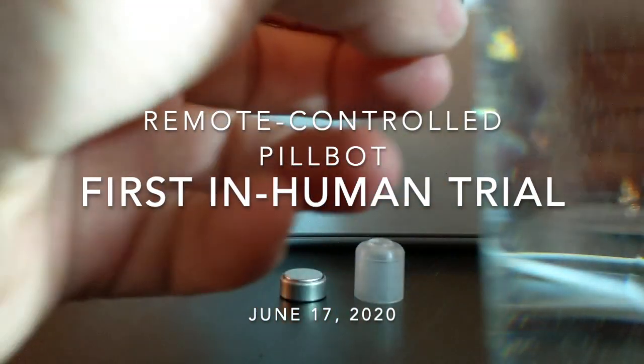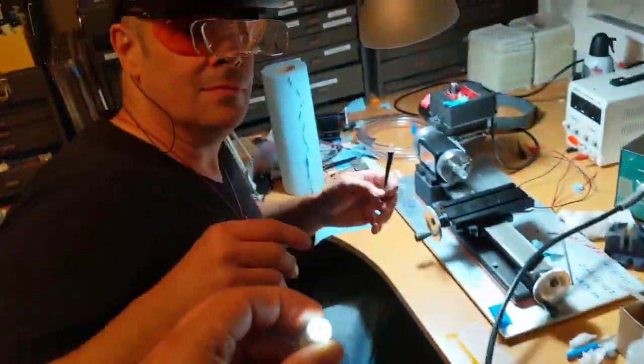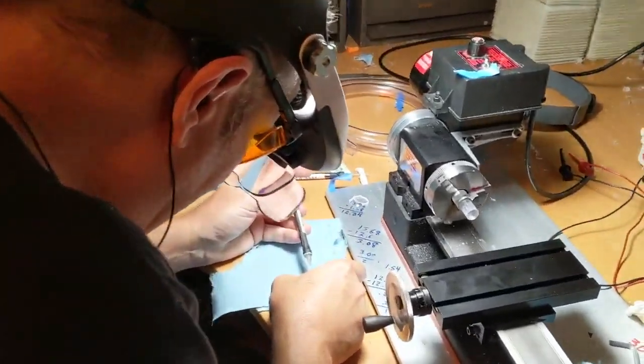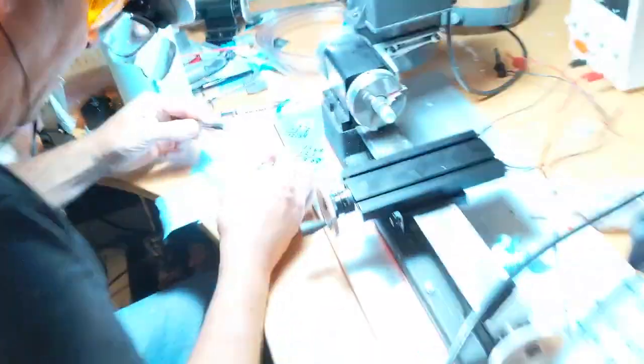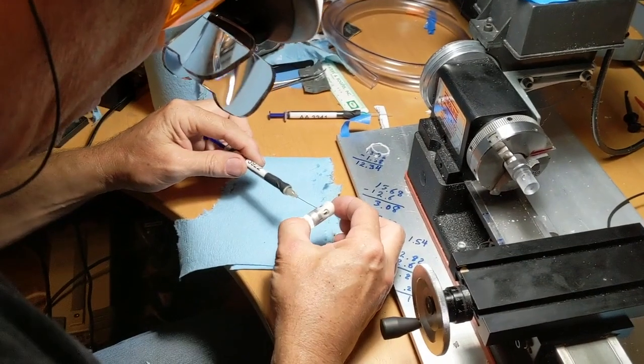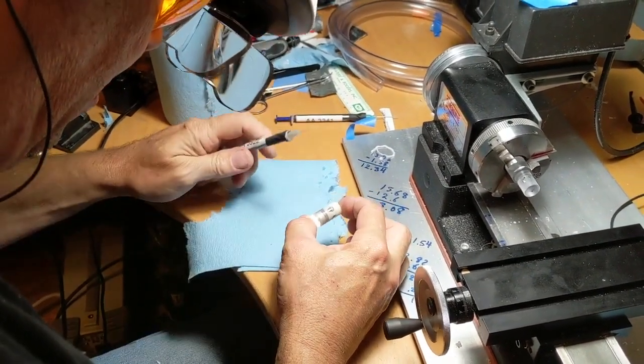Hello folks. We are going to assemble a robot. And go — we are live with battery. I'm going to hand this over to James. James is going to UV glue the robot together so we're not using tape this time. This is permanently glued together. Just carefully going around the perimeter.